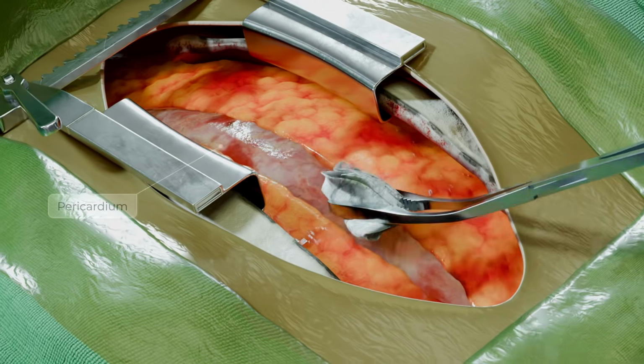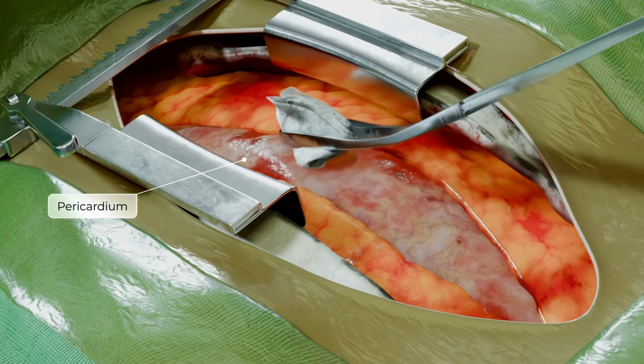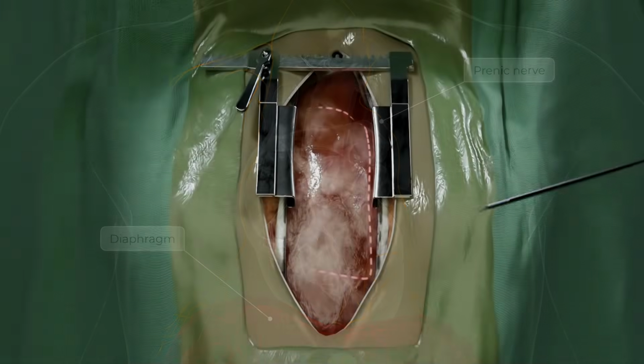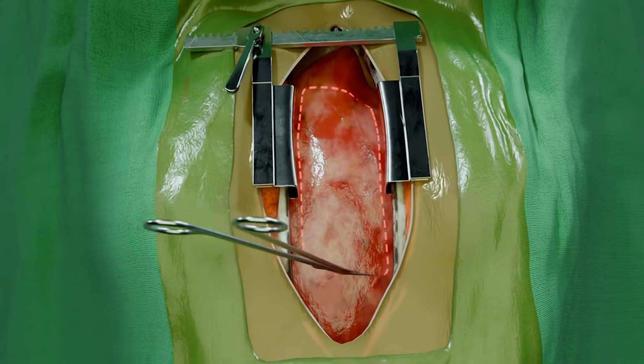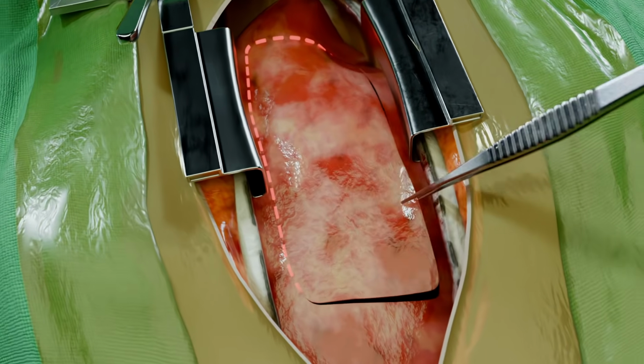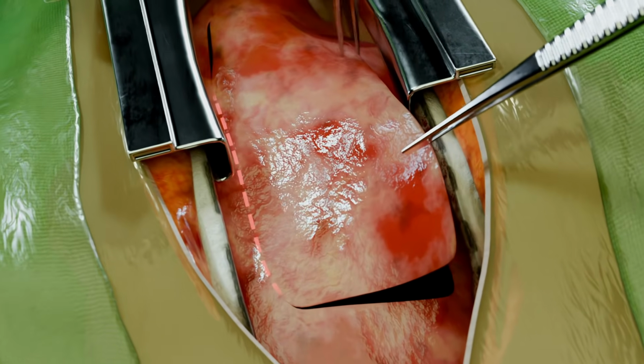The pericardium is dissected from the surrounding tissues. When harvesting its fragment, it is important to consider the course of the phrenic nerves and the position of the diaphragm to avoid injury. In addition, caution is required due to the close proximity of the beating heart.